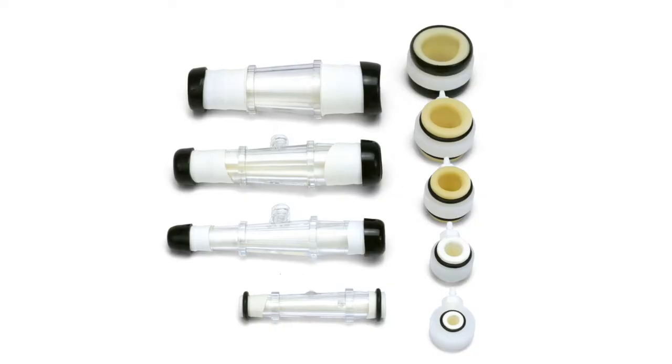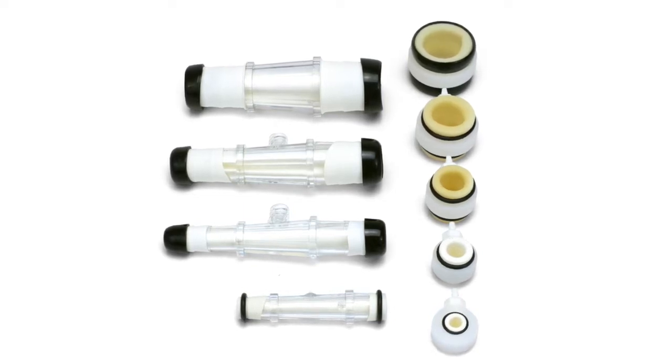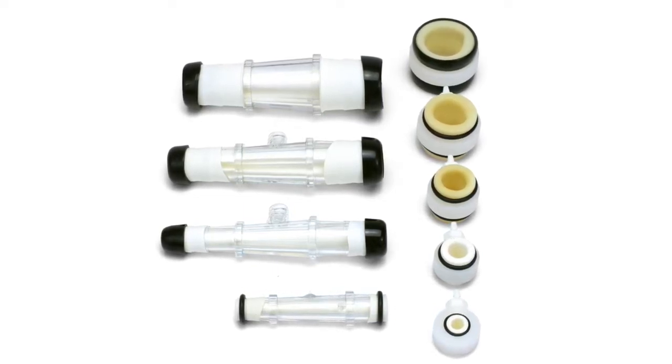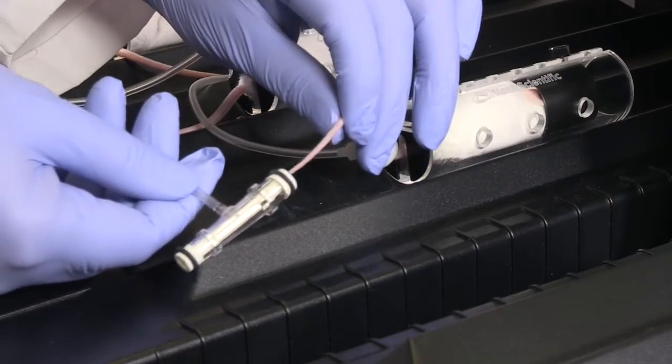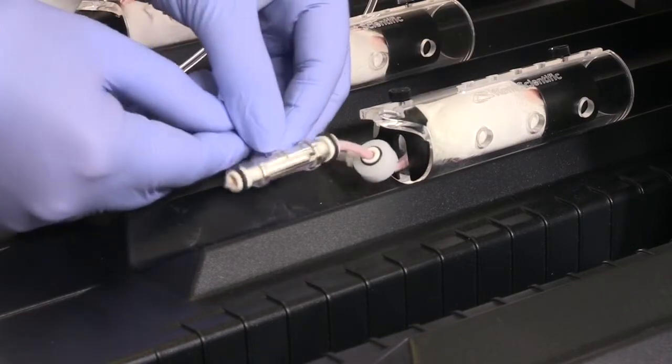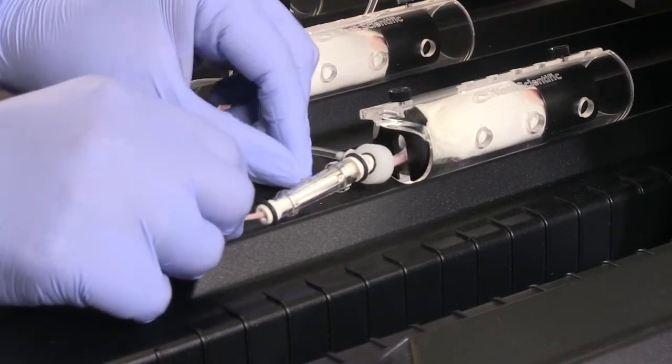Two different cuff sizes are provided with each cuff kit. Choose which size fits best and be consistent in the size and placement across each of your animals. After the occlusion cuff is placed, slide the VPR cuff behind it. The VPR cuff should fit loosely.